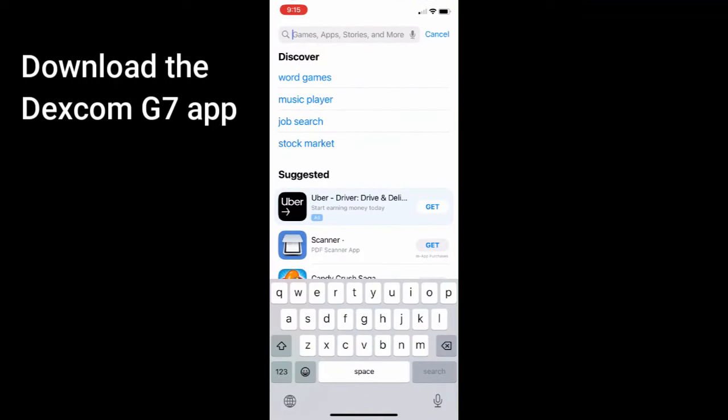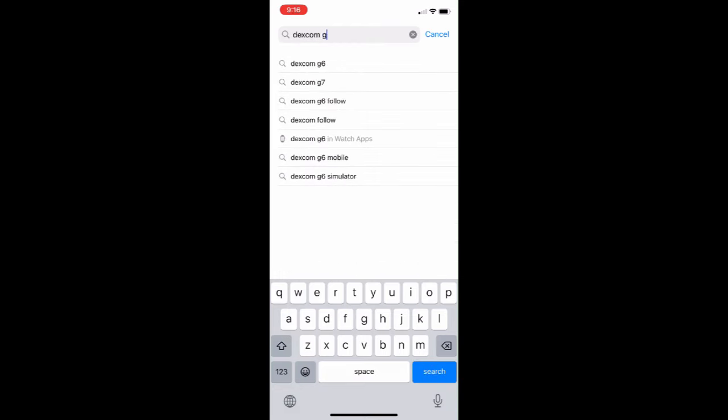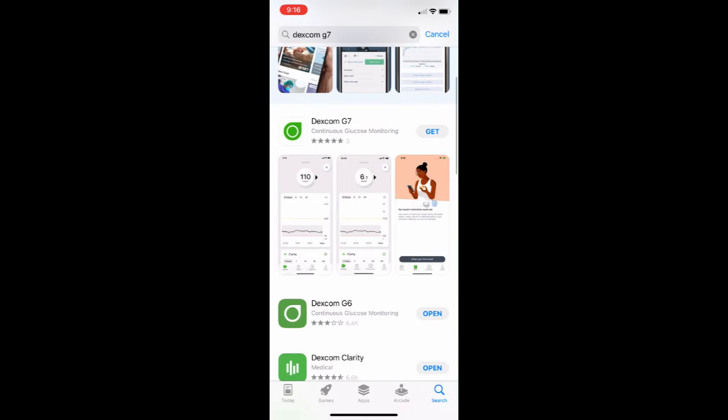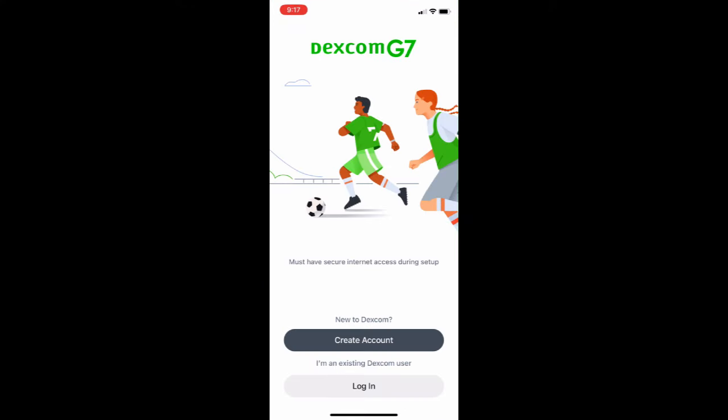You need to download the Dexcom G7 app. I have an Apple product here so I'm downloading from the App Store. Just type in Dexcom G7, here it is, and just click Get. It's a free app so you just download it and it'll be on your phone. Once downloaded, you have to log in. If you have never used a Dexcom G7 before, you have to create an account. If you already have a Dexcom account, you just use that.